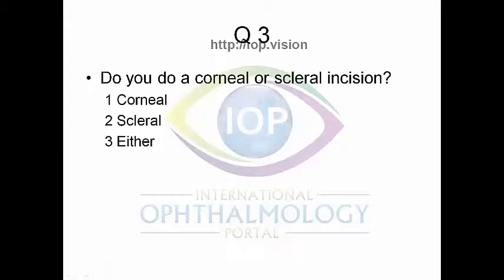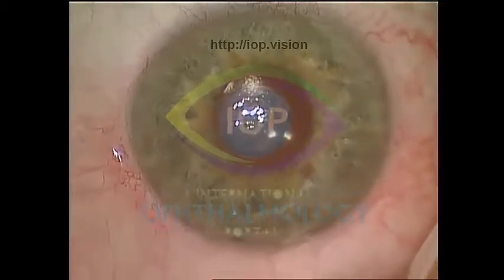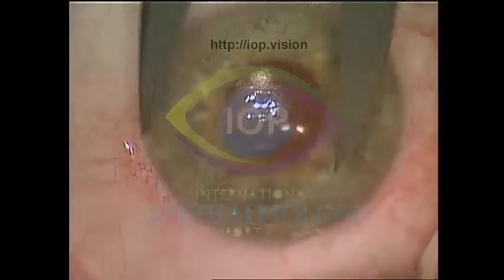So question 3, I think you've answered this one already. Do you do a corneal or scleral incision? And you're saying you've moved from a scleral incision, where you'd have to open up the conjunctiva and do a scleral tunnel. Now you're doing more a corneal incision. Yes. I would be interested to know your thoughts about this as well.